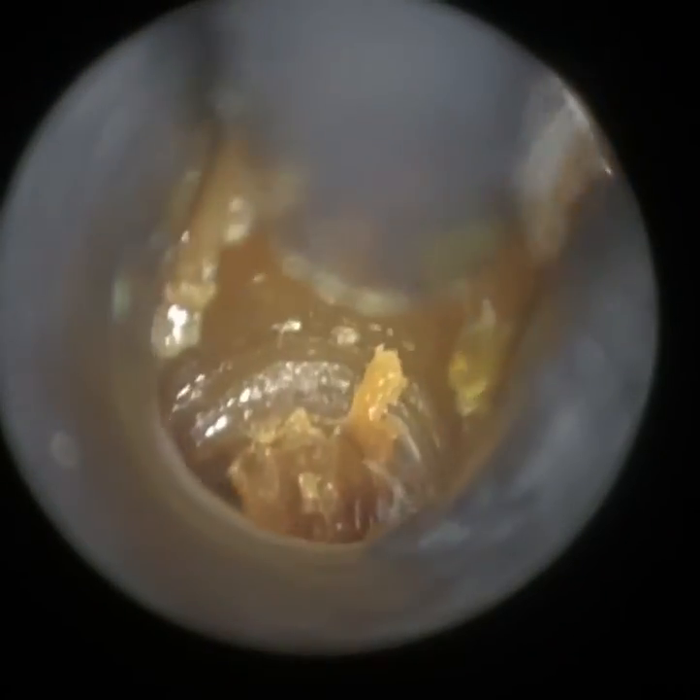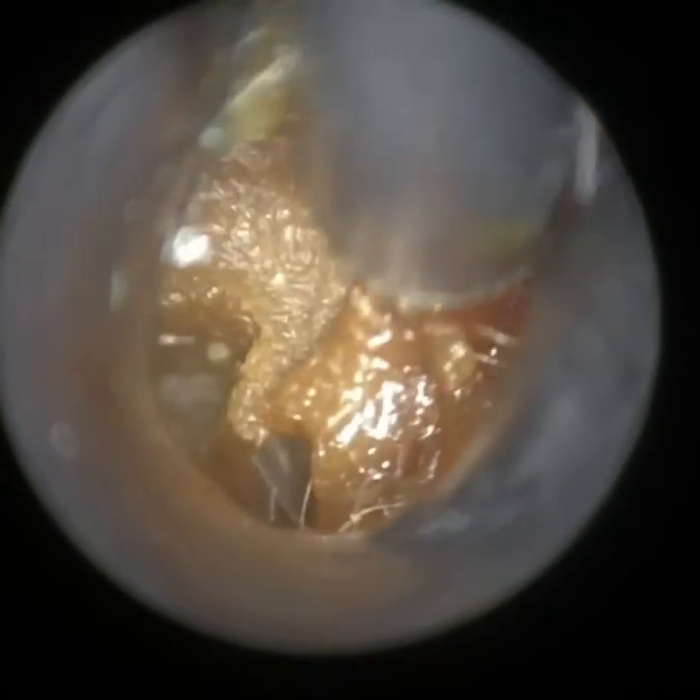I'm using our smallest speculum here — our 3.5mm — but it being a child, the ear canal is quite narrow and bendy. I'm just using it to straighten and dilate the ear canal. And I'm just going superiorly here, trying to release this wax plug from the roof of the ear canal.